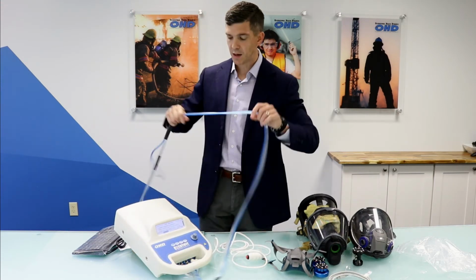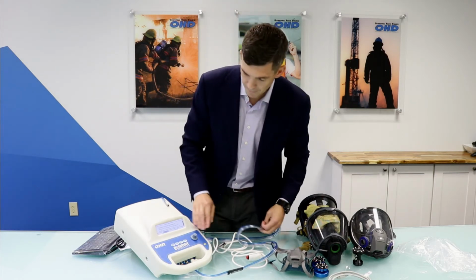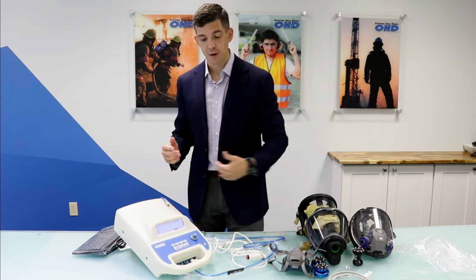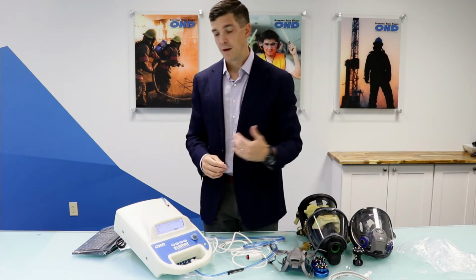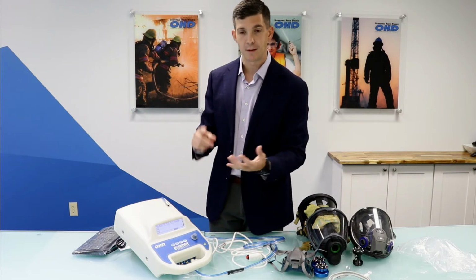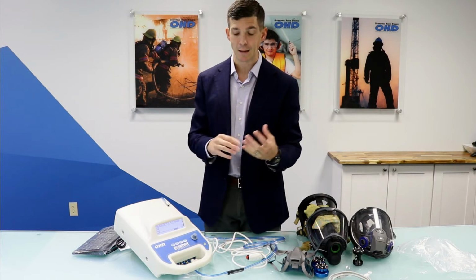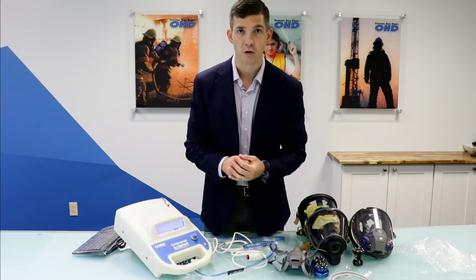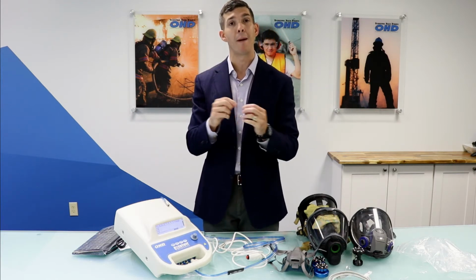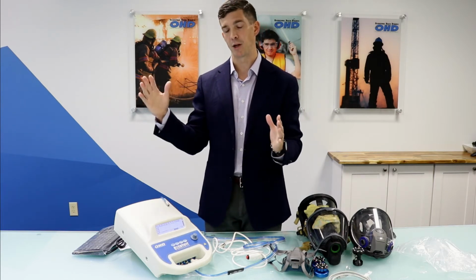Now, what you'll see is what we call a closed loop. So this loop, when we hit start, will actually push different amounts of air pressure through. The sensor will measure this different amount of pressure to make sure that the pump is working. It'll make sure the sensor is properly measuring leak. There's a leak orifice at the front of the tube where we know we have a known calibrated amount of leak that we are aware of, and we should see that consistently at every pressure level.